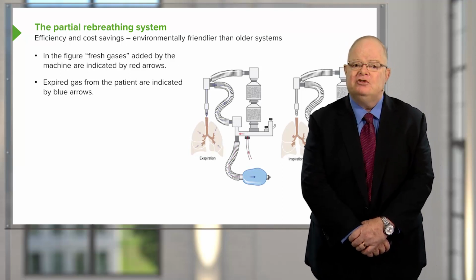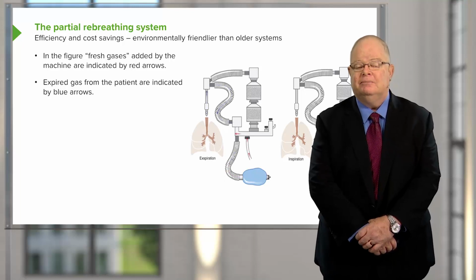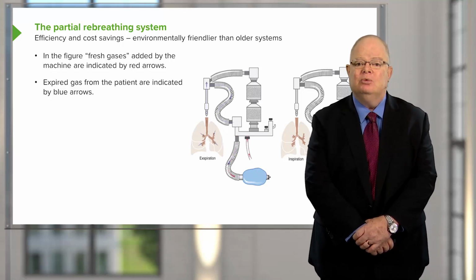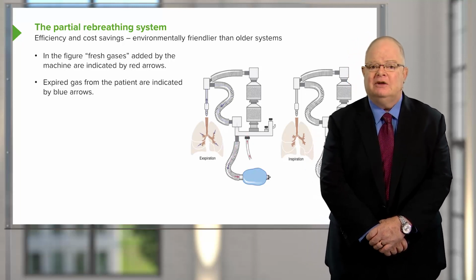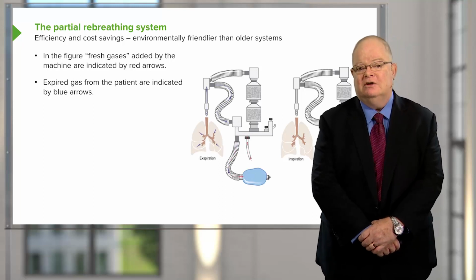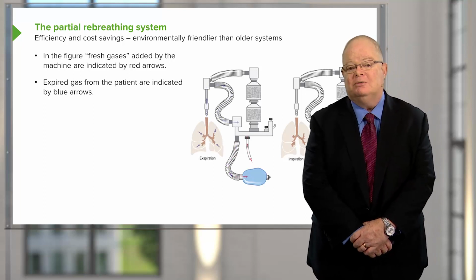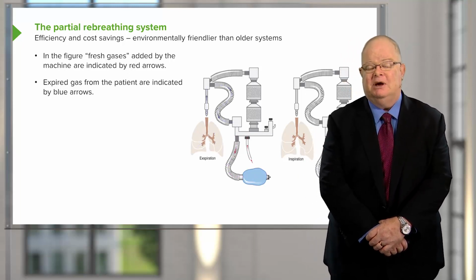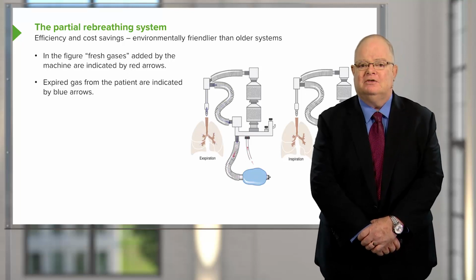The only thing the patient does in response to this is produce carbon dioxide. We can't allow the patient to rebreathe the carbon dioxide because that would result in the respiratory acidosis we talked about earlier, would cause tremendous stimulation to ventilation, and in fact would make it almost impossible to safely anesthetize the patient. So we have to scrub the carbon dioxide out of the expired gases.